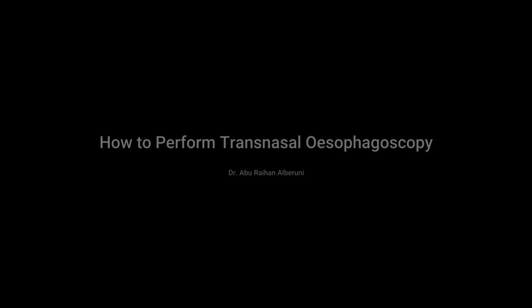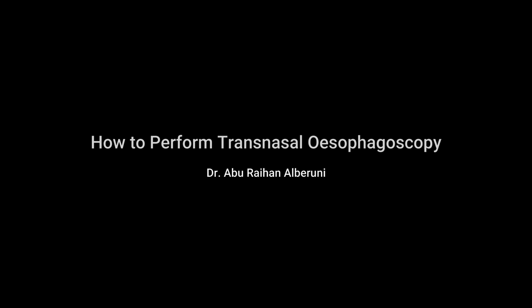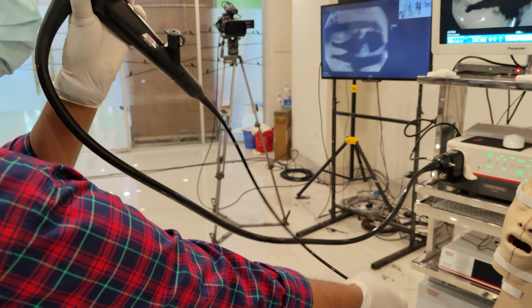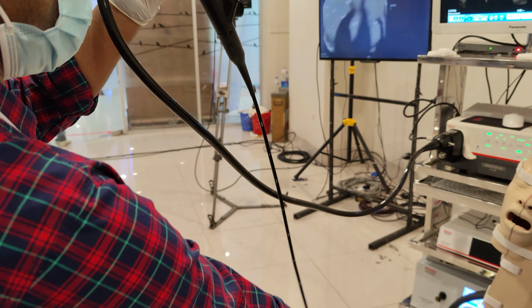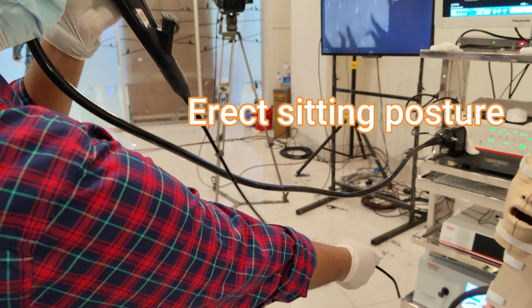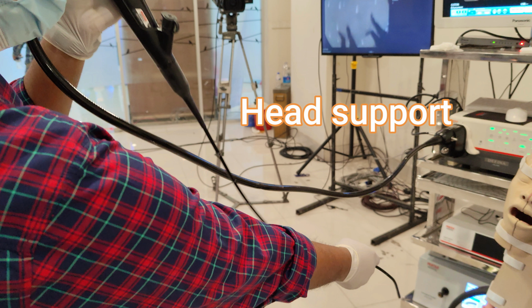So we are going to perform transnasal oesophagoscopy over a dummy. Ideally, in case of transnasal oesophagoscopy, first the patient should be explained about the procedure. The patient should sit in the chair with an erect position. Patient may be supported from behind if needed.